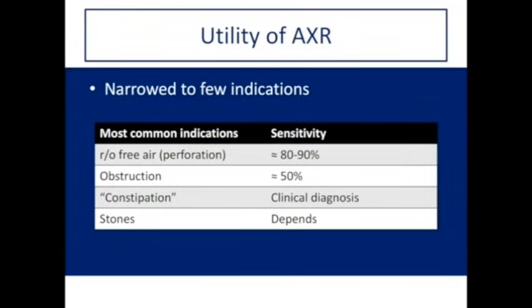The utility of the abdominal X-ray in today's practice, practically speaking, is very limited. With that being said, abdominal X-rays are still ordered relatively frequently in a few discrete clinical situations, and I've listed a couple of them here and the sensitivity of abdominal X-ray in these clinical situations.